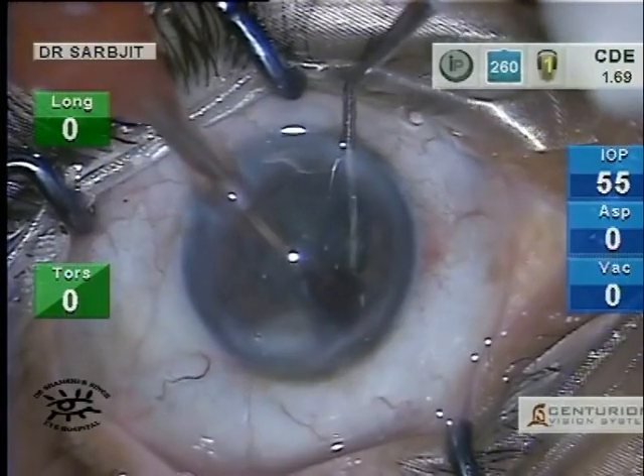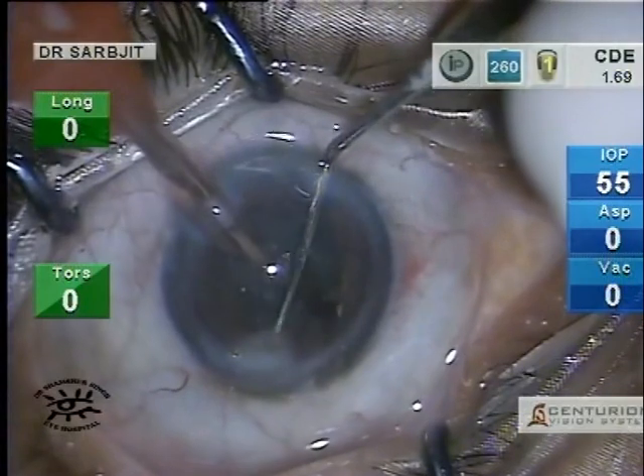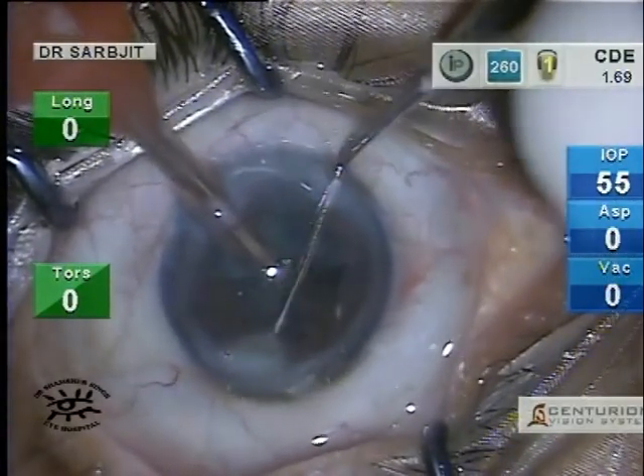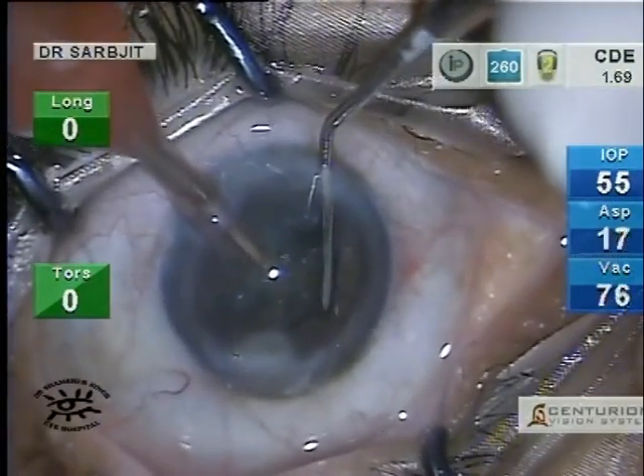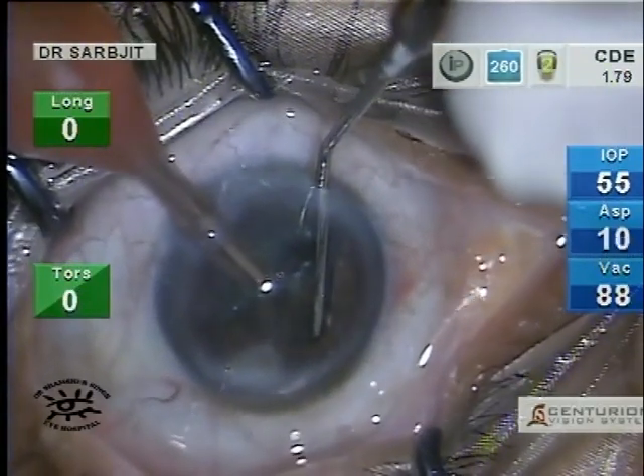I aim for about six fragments of the nucleus. If the nucleus is harder you can always make more.